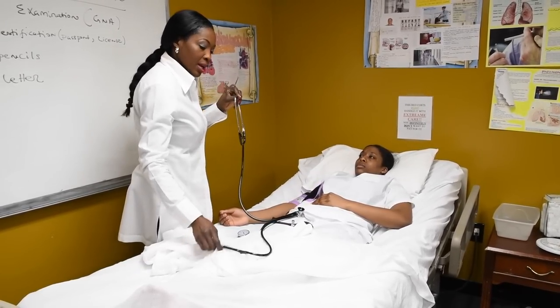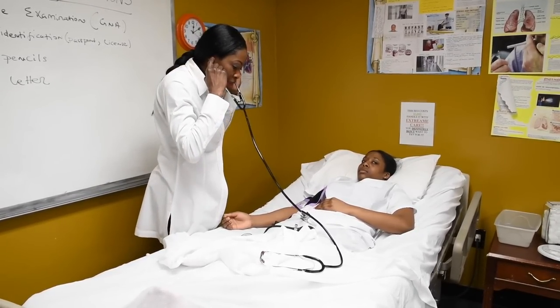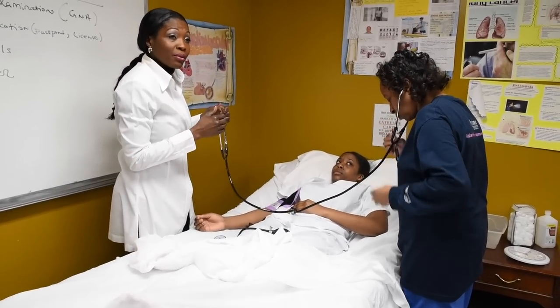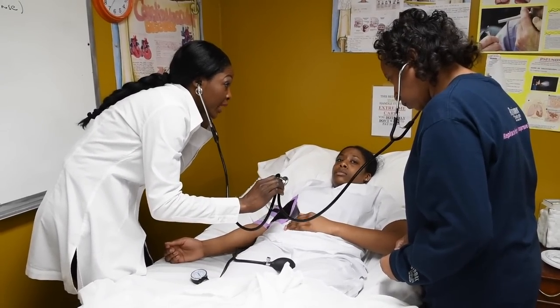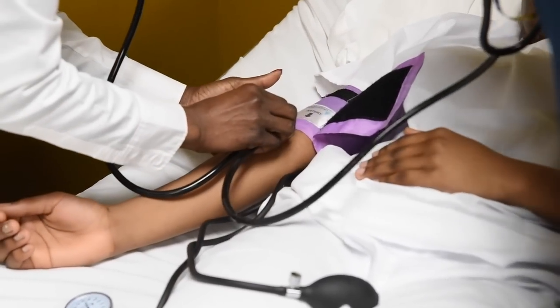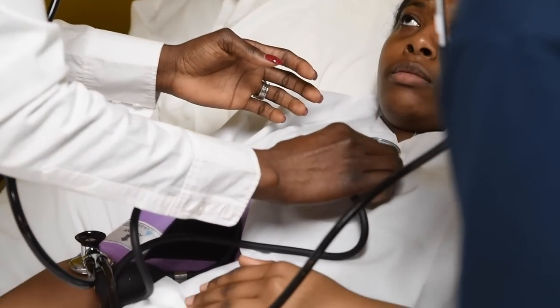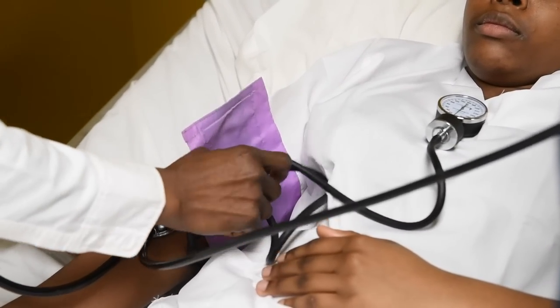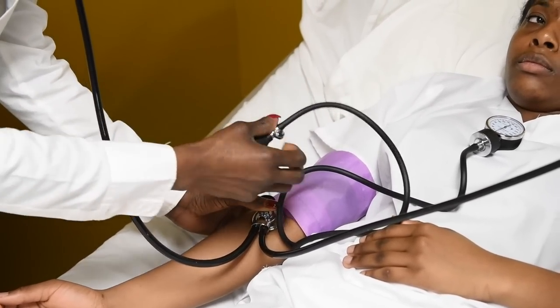Take my earpiece, hand this to the examiner. Can I do it with you, please? I just want you to get a full picture. Like, this is my examiner, that's how it's going to look, okay? You do this. They are just here to listen with you. They're not doing any of the steps, okay? You place your hand at the brachial artery. Okay. And you place this part on your client's chest so you and the examiner can hear, okay? So I'm the student, I'm doing everything. She's just going to watch and listen.